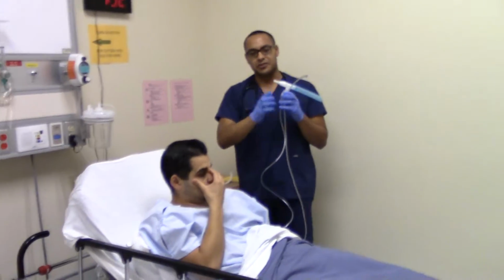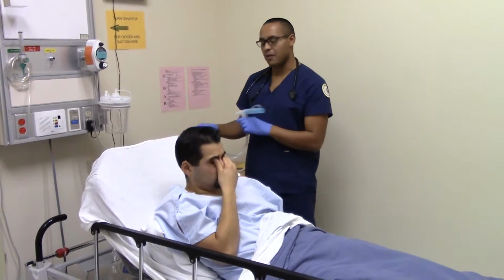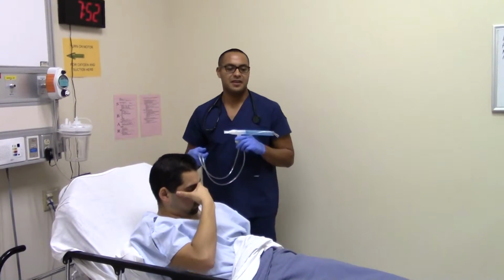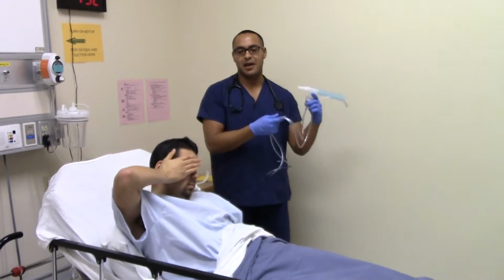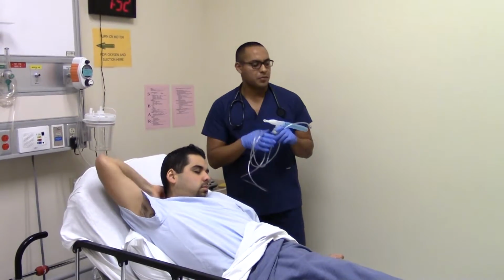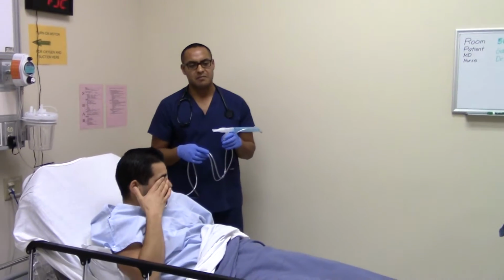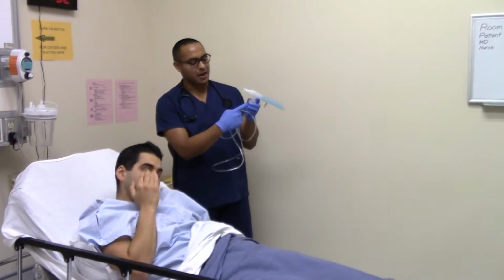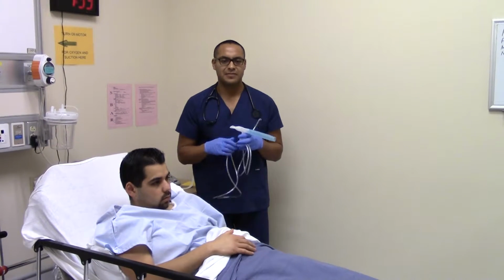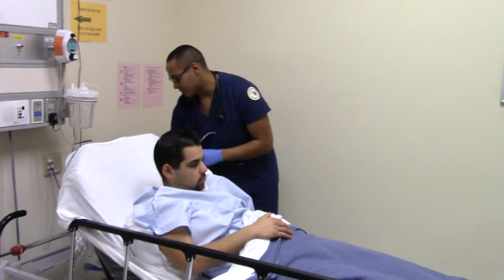If you already filled the treatment, there's a bag here for the patient. You put it in the bag with the patient's name, so you can identify that it belongs to the patient. This comes in the bag. Cleaning it, you want to use distilled water and let it air dry. Cleaning in the baffle, if you rub in there, it creates static.